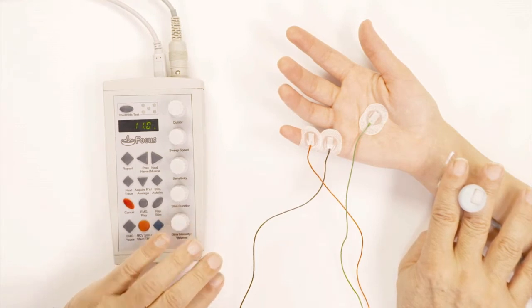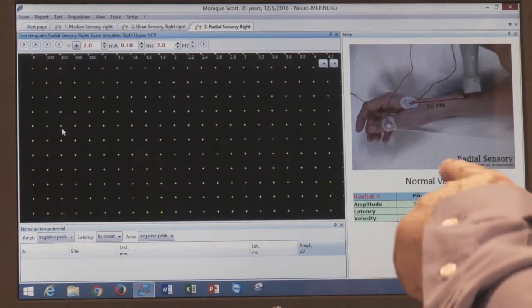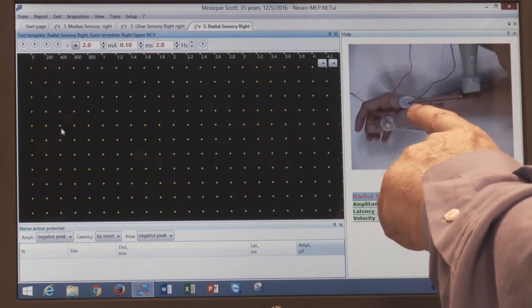Now I'm going to move and do the radial sensory by pressing on the next button right here. This is a radial sensory, and as you see here I stimulated the radial nerve in the forearm, not at the wrist anymore.